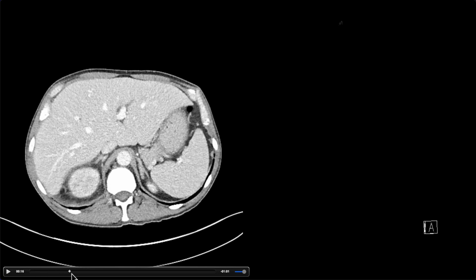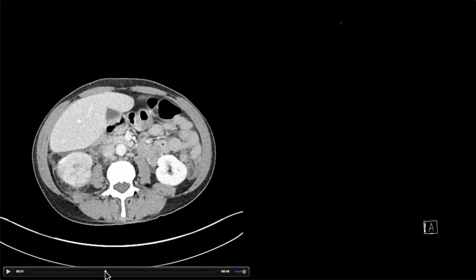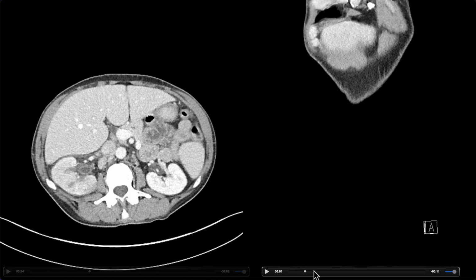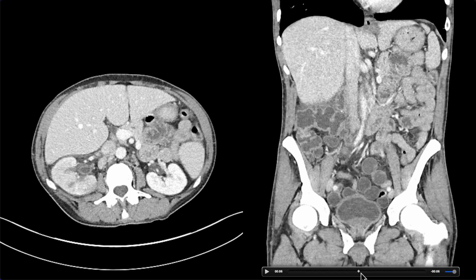All right, so for our first case here, the idea with a lot of these cases is to build on them sequentially. So we're going to start with a basic or foundational theme and then view some complicated forms of it or some important mimics of those disease patterns.